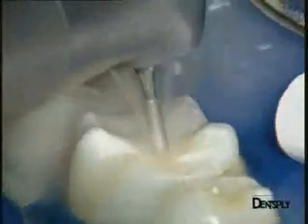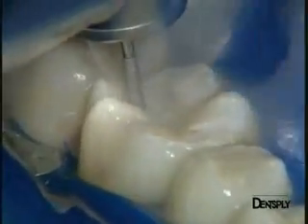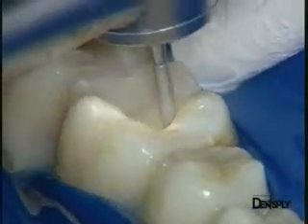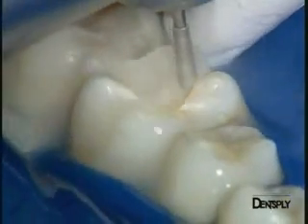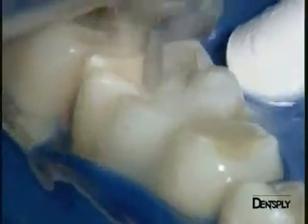The first stage consists of removing all the old restoration, being careful to preserve the remaining dental tissues. A pear-shaped burr, reference 830, is chosen for the purpose and we proceed progressively, starting from the centre of the restoration and moving then to the edges. By transparency, the dental tissues can be easily distinguished from the composite material. The thickness of the remaining dental tissue is very thin at the distolingual cusp, and it is already clear that it will need replacement.